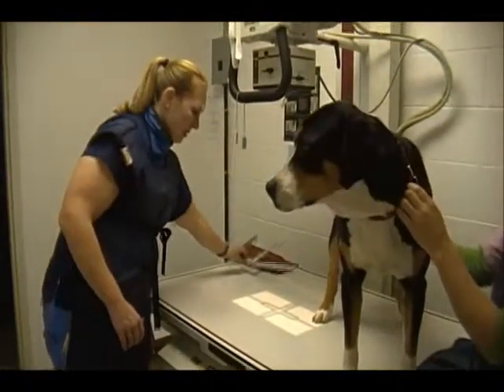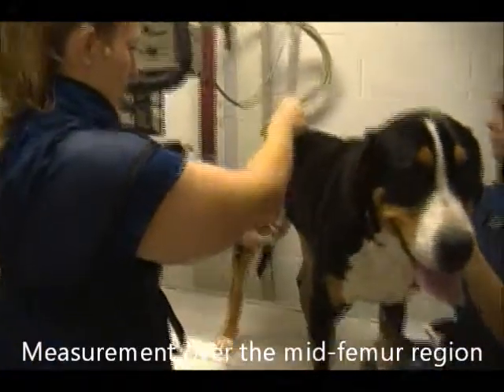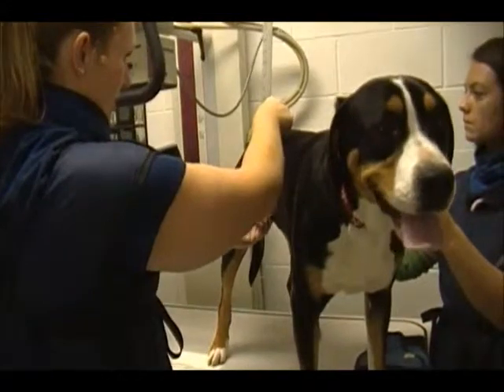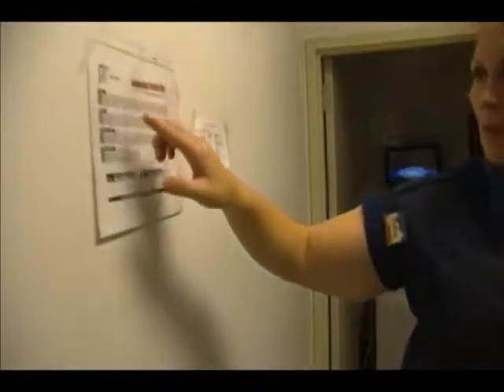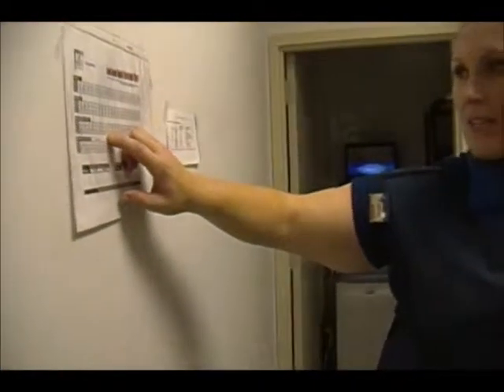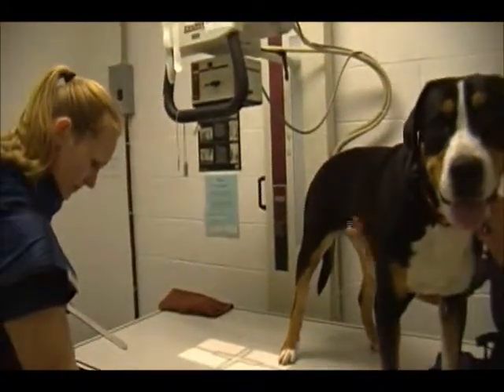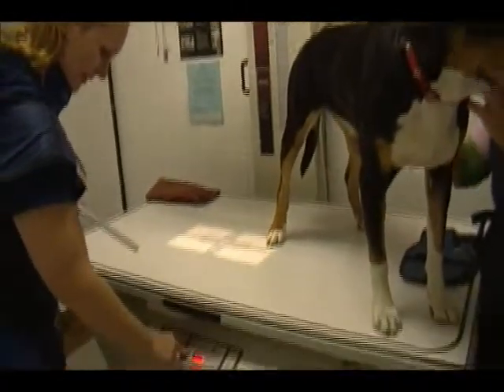We're going to start by taking our measurement with the caliper in the pelvic region and we're going to determine that to be about 18. Referring to the technique chart over here on our wall, for the pelvis region 18 centimeters would be set at 72 kVp and 10.5 MAS. On this machine we'd have to go to 10.